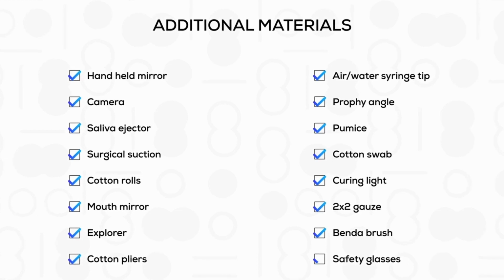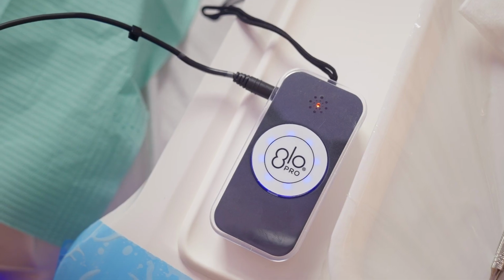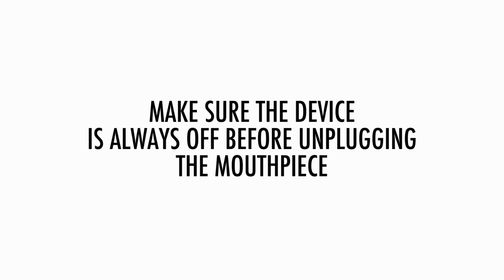Before we start whitening, here are a few really important things to know. The device must be fully charged for 5 hours before first use. To turn the device on or off, please double-tap the GLO button. Never disconnect the mouthpiece cord while the device is still on, as it could result in device failure. Ensure all lights are turned off from the device first.